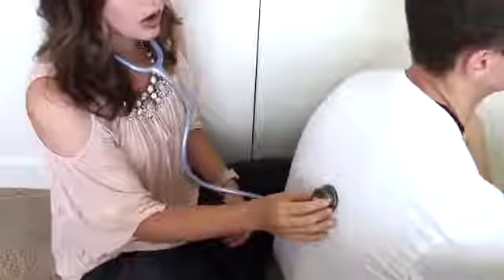You don't want to go down one side first and then the other because you're comparing the lungs bilaterally. So I start on one side and I always ask my patient to take a deep breath in and out. Okay, you don't have to actually do it. And then I do the same thing. I have them take a deep breath in and out, and I go all the way down.